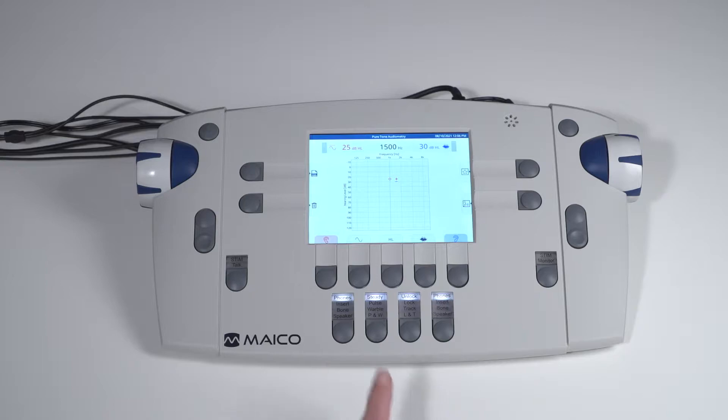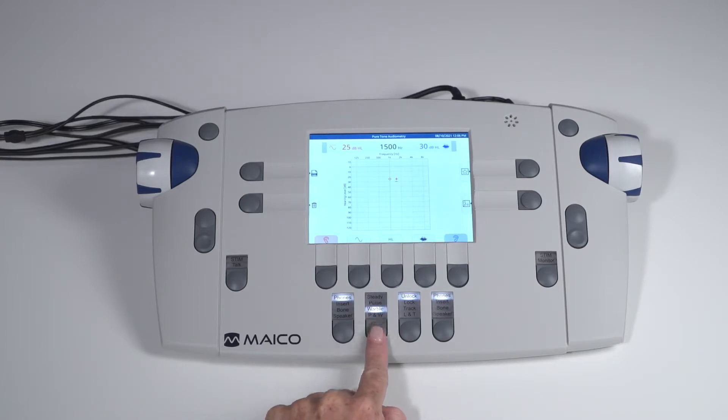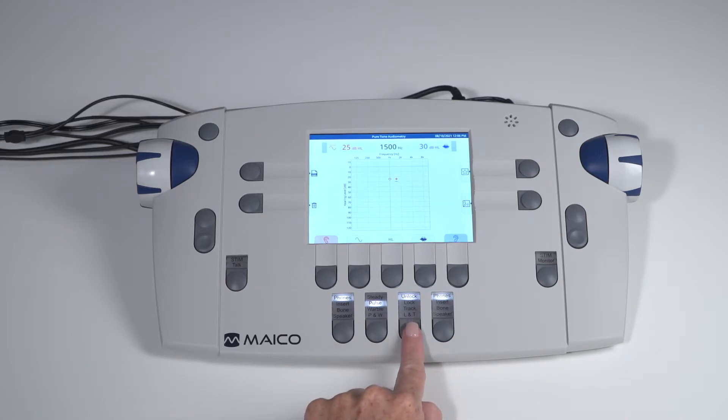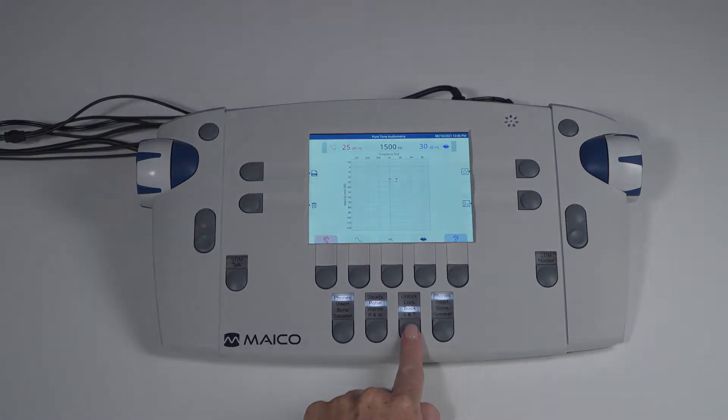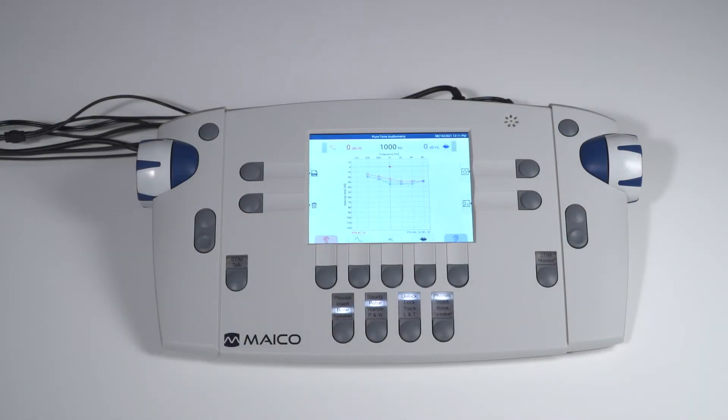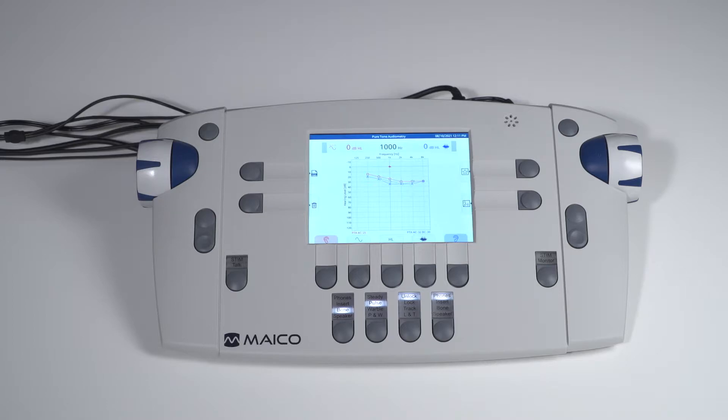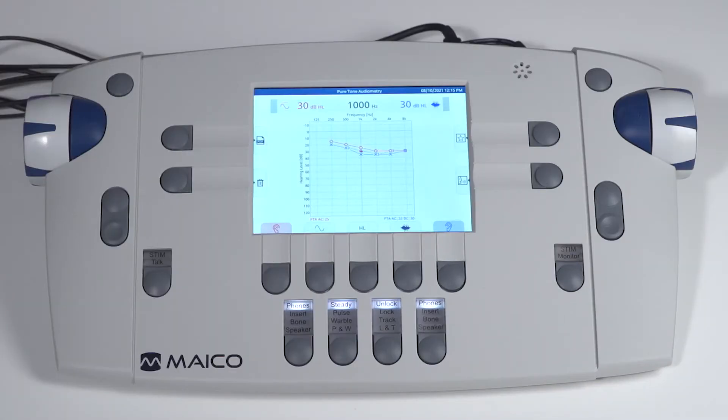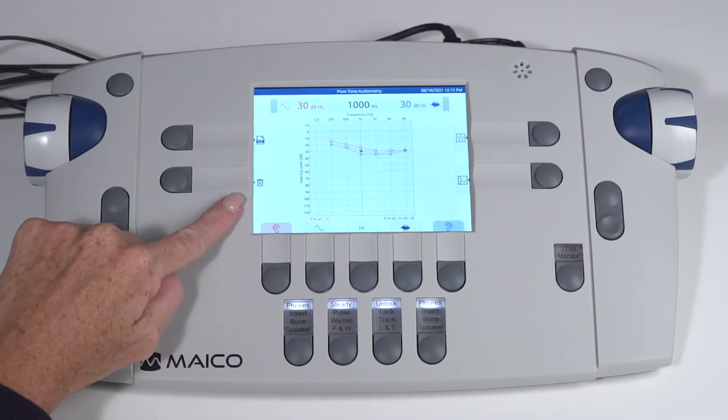Change the tone to pulse or warble with the selection key. Next to that, you can select to lock the stimuli of the two channels or track the channel levels together. Keys around the display change function depending on the screen you are in. These keys have two operation modes, a quick select and an advanced select. With quick select, the icon shown next to the key indicates what action will be taken. When a closed arrow is shown on the key display, this indicates advanced selection is also available for that key.